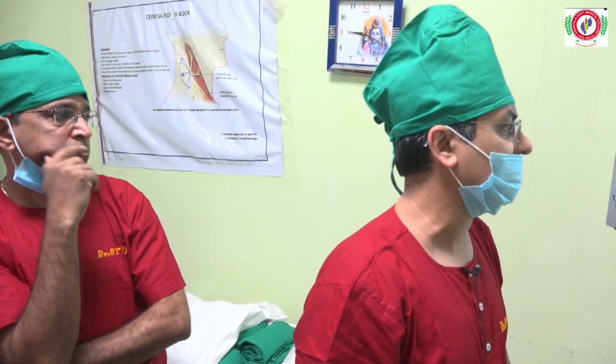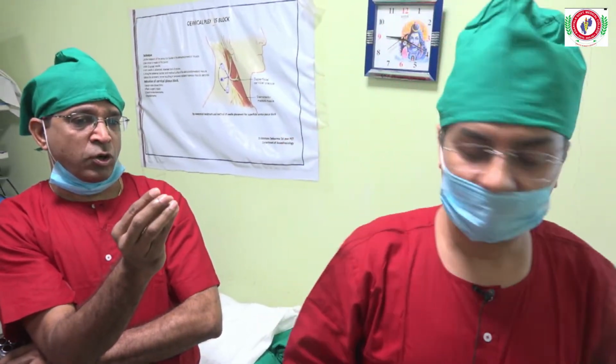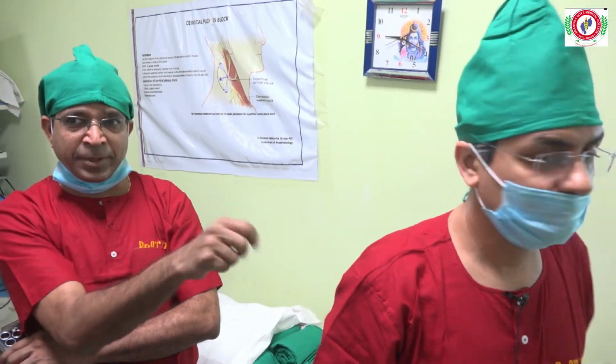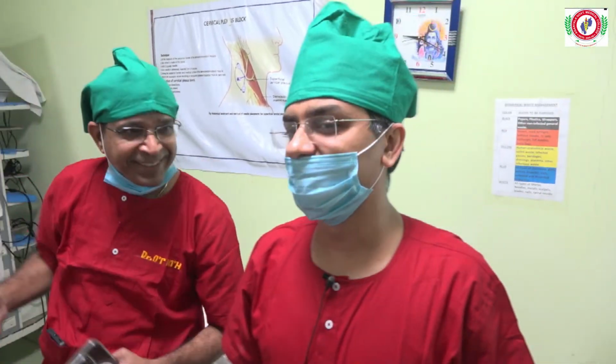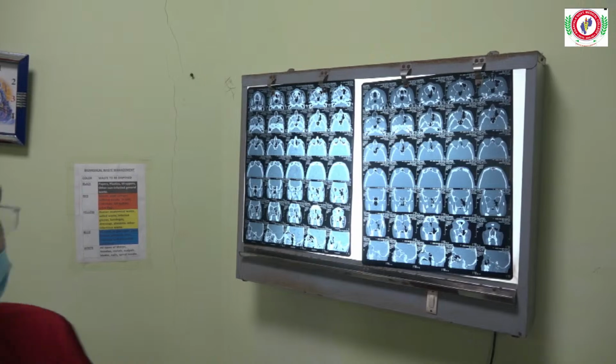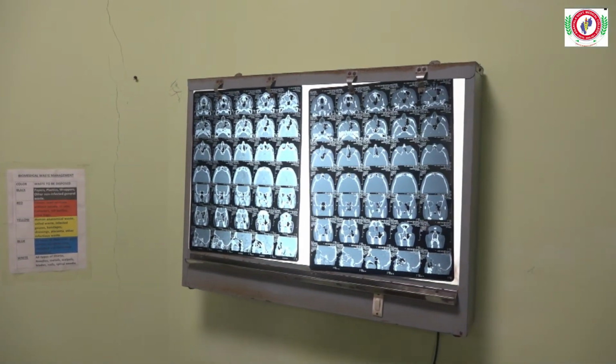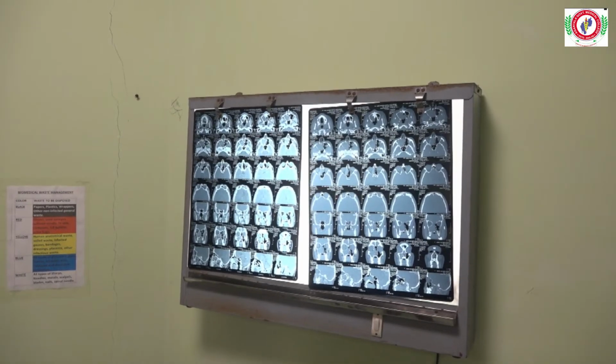Follow-up endoscopies are very good. Actually, we have one issue here. We have a straight blade only. We don't have a curved debrider blade, 40 or 60 degree. So everything we have to do with a 0-degree debrider blade. Use the angled forceps with a cotton ball or gauze and scrape the disease off the bone.